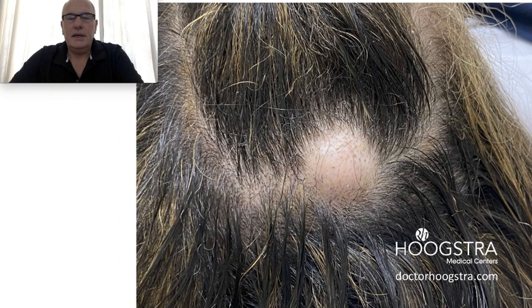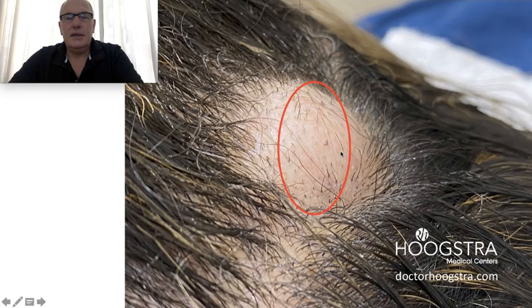We can see here the tumor, and this is the conventional surgery to remove it — cutting all the skin here, and after the cutting it's easier to remove the tumor. They put several stitches here.